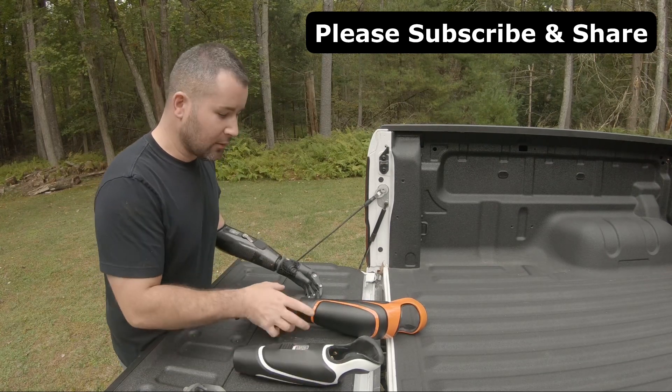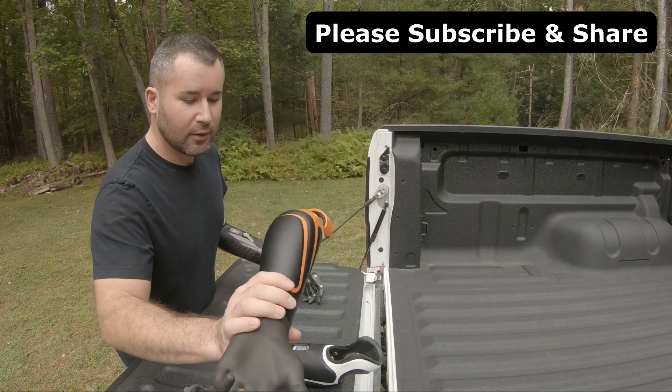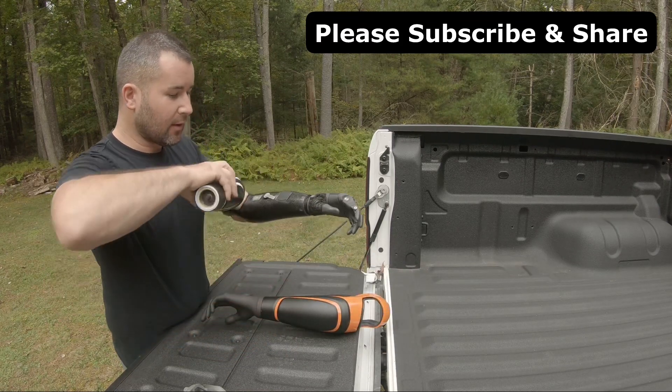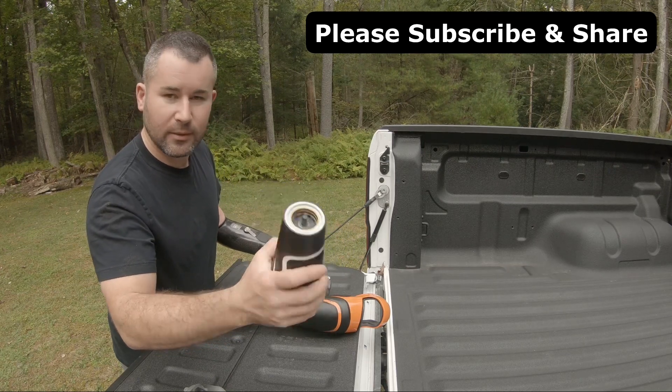These are 3D printed. So you have this arm — it's a passive arm — 3D printed. And this is their myoelectric version, so it allows you to hook up whatever hand you want on the end, or a gripper, whatever the case may be.